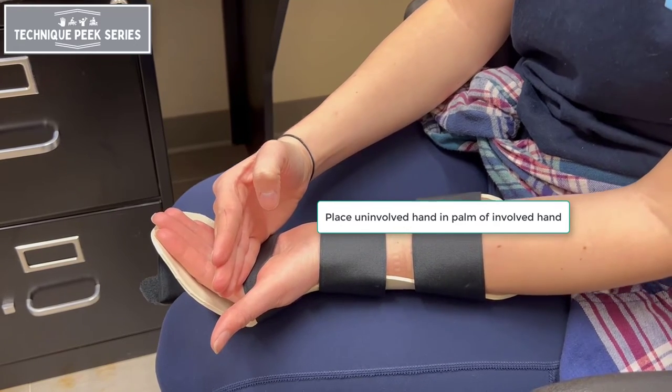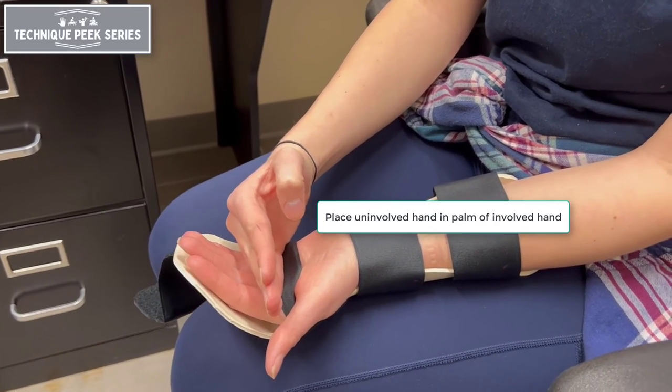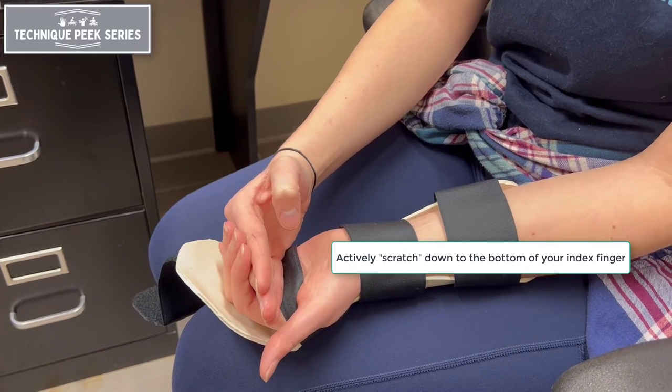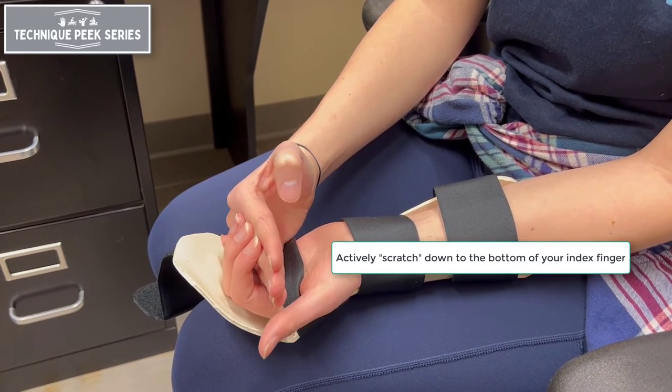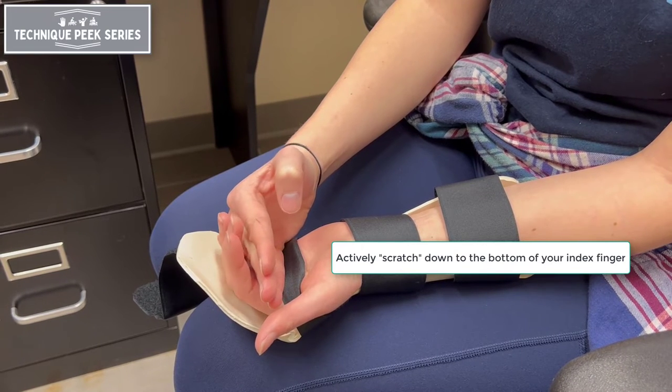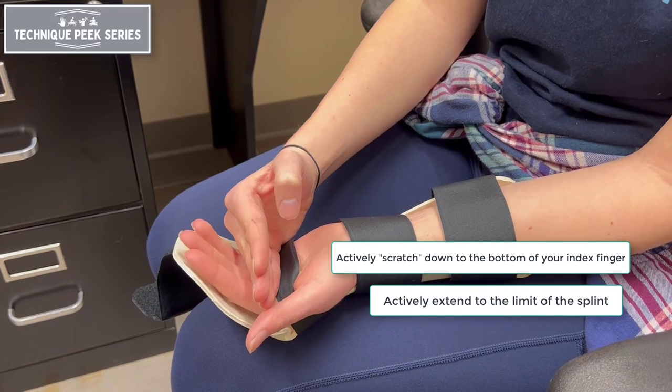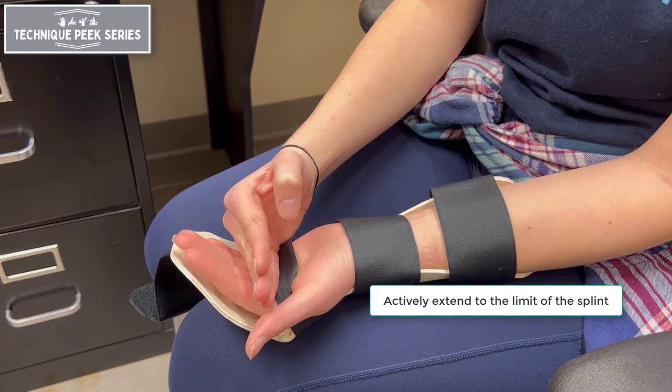Placing the uninvolved hand in the palm of the involved hand during week one, instruct the patient to actively scratch to the base of the index finger, actively extending to the limit of the splint with each repetition. This exercise should be performed 10 repetitions, three to five times daily.